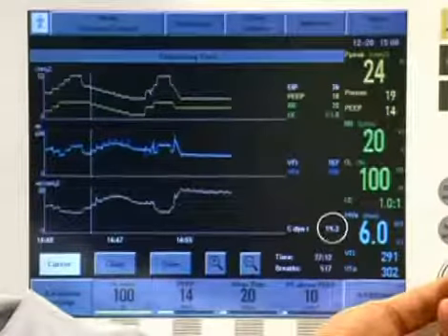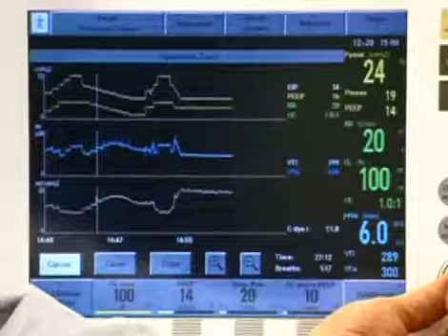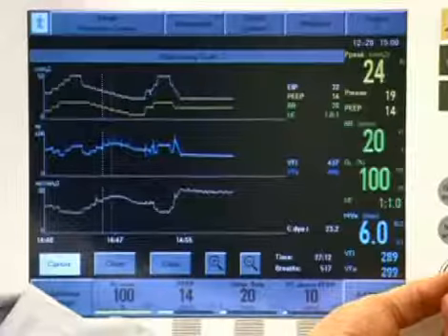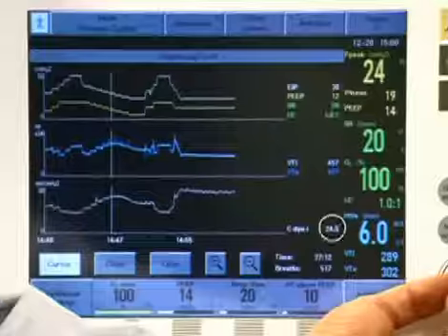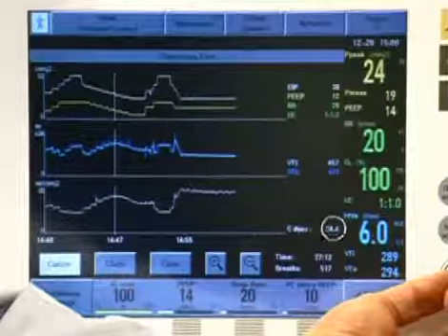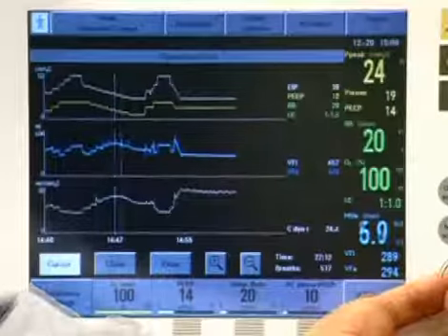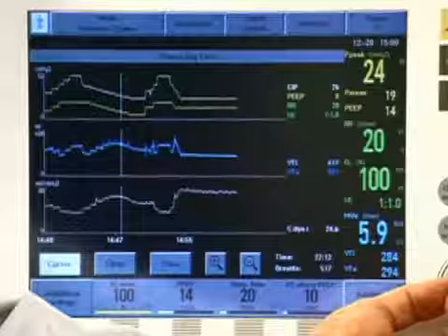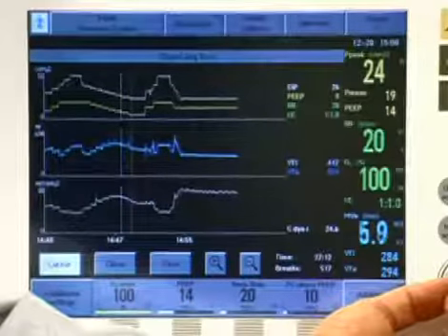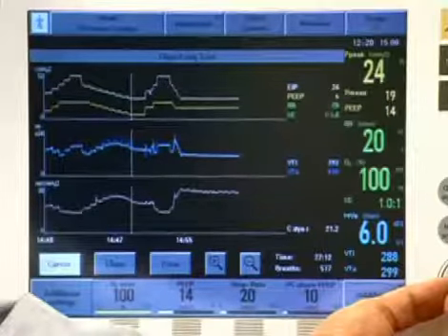18 of PEEP, 19 of compliance, 16 of PEEP, 21 of compliance, 14 of PEEP, 23 of compliance, 12 of PEEP, 25 of compliance. Maximum value of compliance after recruitment, 25 milliliters per centimeter of water and a PEEP level of 12 centimeters of water. Plateau behavior of compliance along various PEEP steps, from 12 to 8 centimeters of water. Decrease in compliance indicating ongoing lung collapse at a PEEP level of 6 centimeters of water.